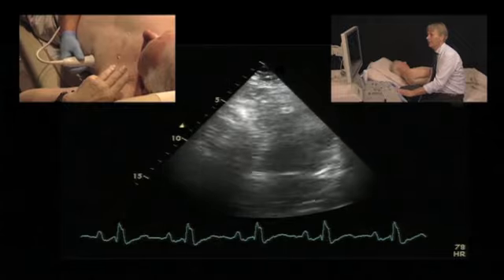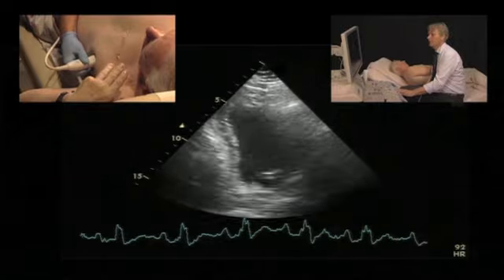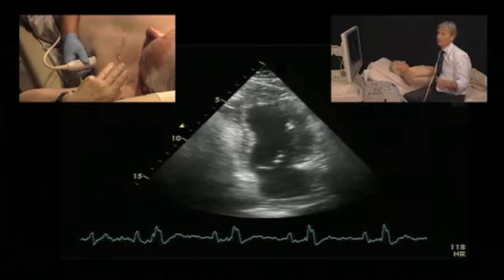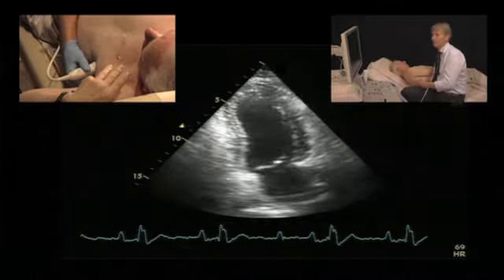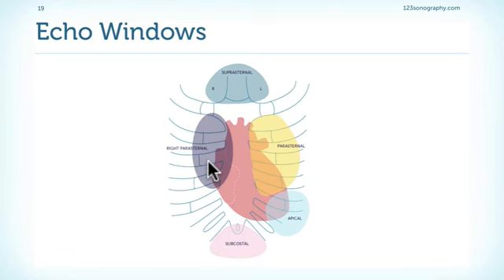Can you inhale? See, and immediately we get, that is too much, exhale a little. We get better image quality. Sometimes he should not excessively inhale, as in this case, but if he inhales moderately, you can see the anterior and the posterior wall much, much better.